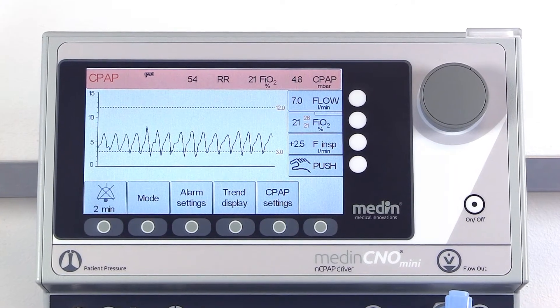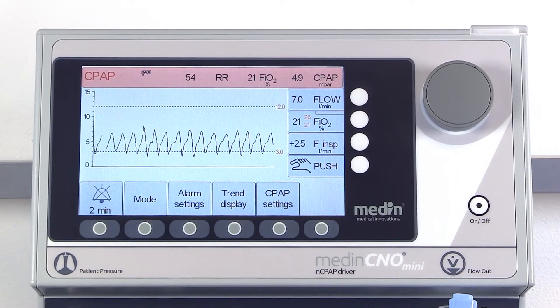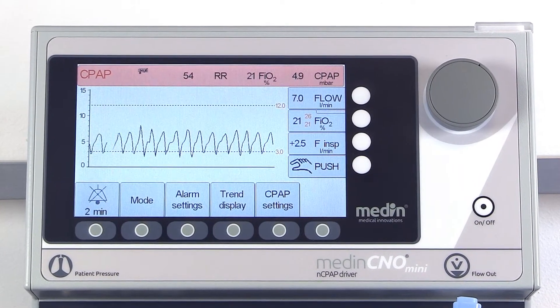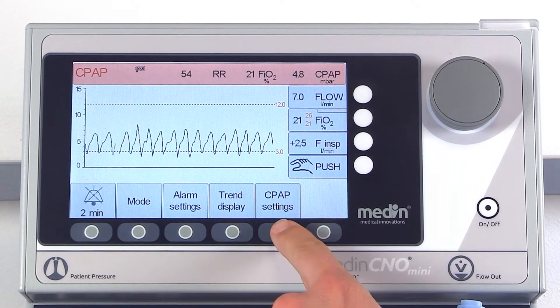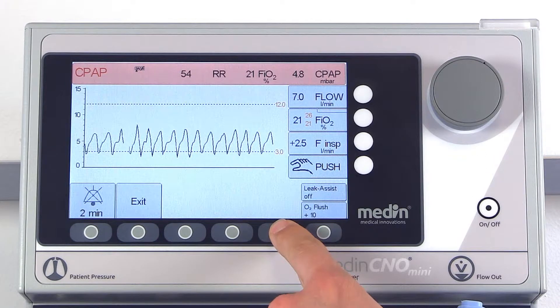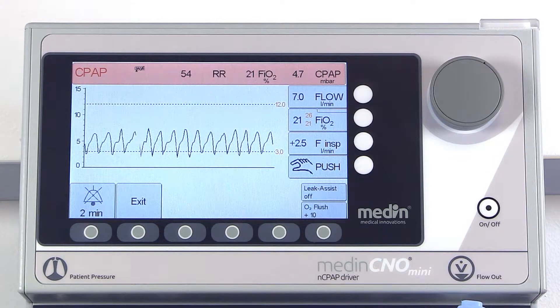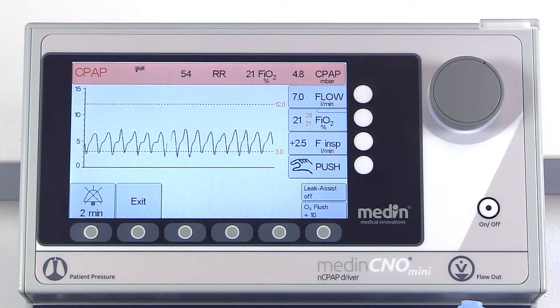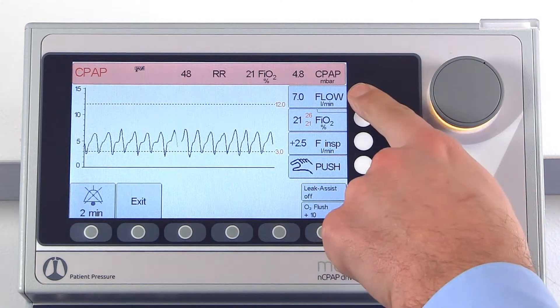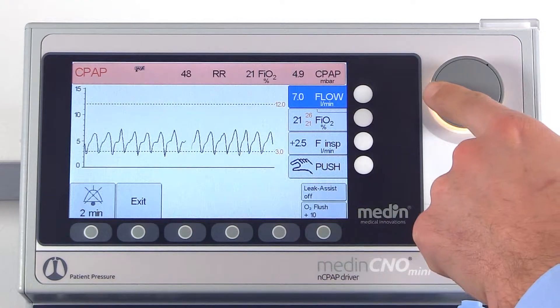The Medin C&O Mini offers a CPAP mode with an optional leak assist function. As in every mode, you can adjust the CPAP pressure using the basic flow.